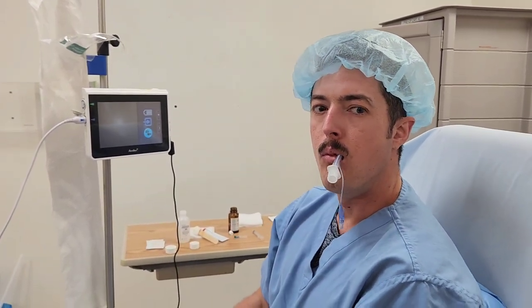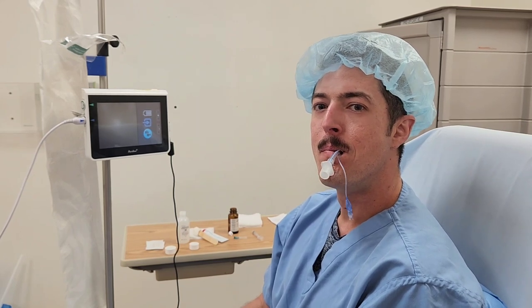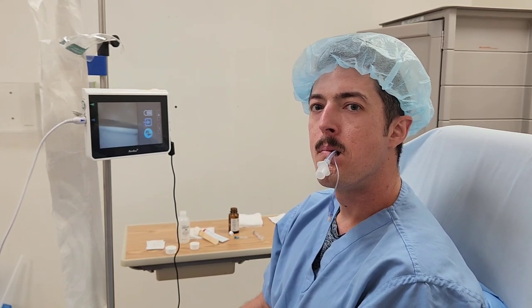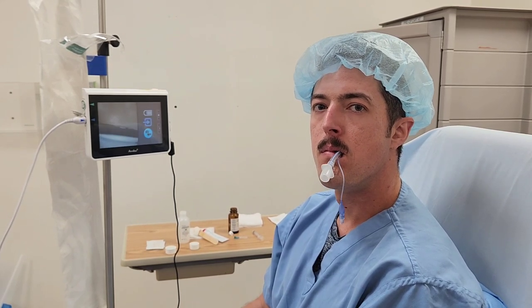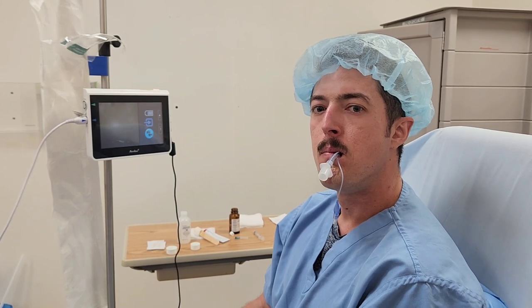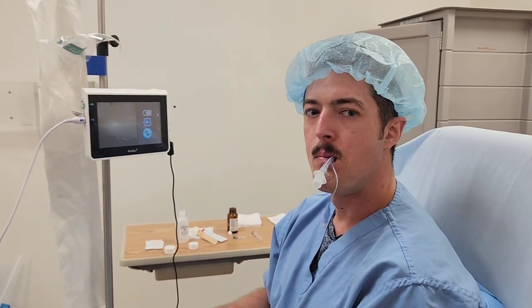Here you can see that Ian is breathing through an ET tube. He can't talk because the tube is in between his vocal cords, but he can maintain his airway. He's ventilating with no issues. And that's how you intubate yourself.